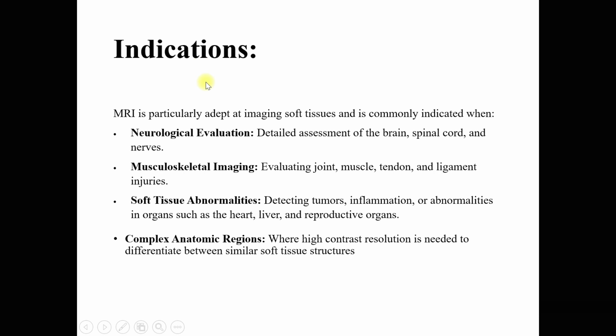Now let's see the common indications of using MRI. MRI is particularly adept at imaging soft tissues and is commonly indicated for neurological evaluation, musculoskeletal imaging, soft tissue abnormalities, and complex anatomic regions. In case of neurological evaluation, detailed assessment of the brain, spinal cord, and nerves.